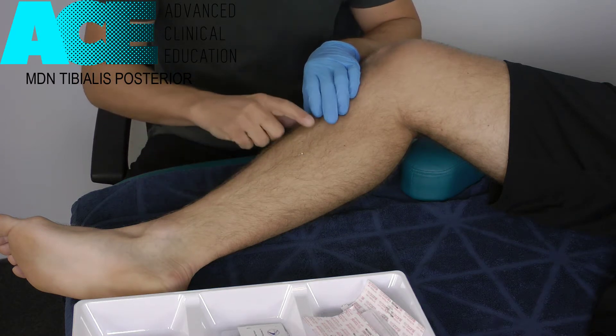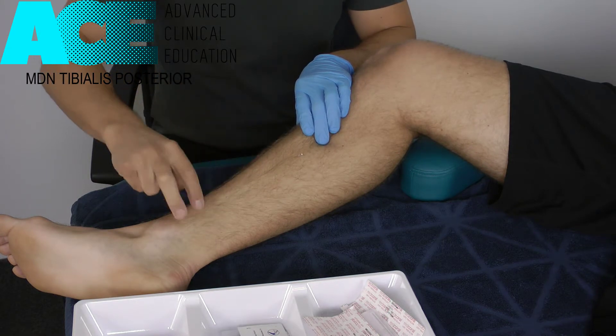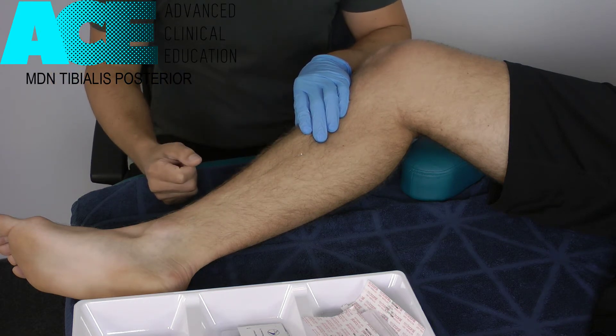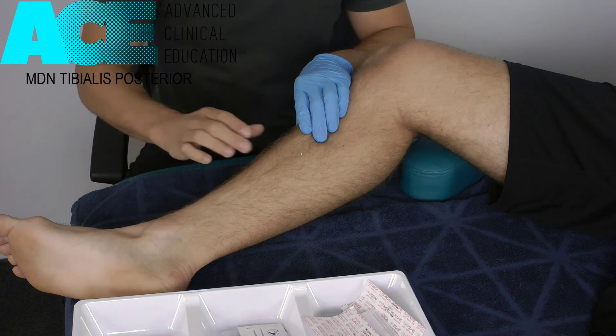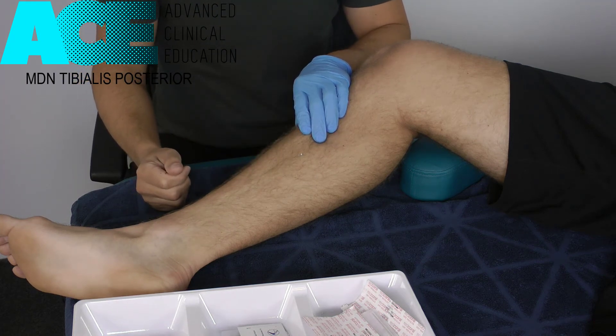We can do that at a number of different points — trust your palpation. Follow that muscle down, feel the points of tension, staying away from the tendon of tib post as we don't need to needle tendons. Work up into the belly. This is a fantastic way to get into that space — it's actually quite comfortable to needle but quite uncomfortable to do soft tissue work on, as it can be very tender in there. So dry needling is probably a less invasive, more comfortable way of treating that muscle.